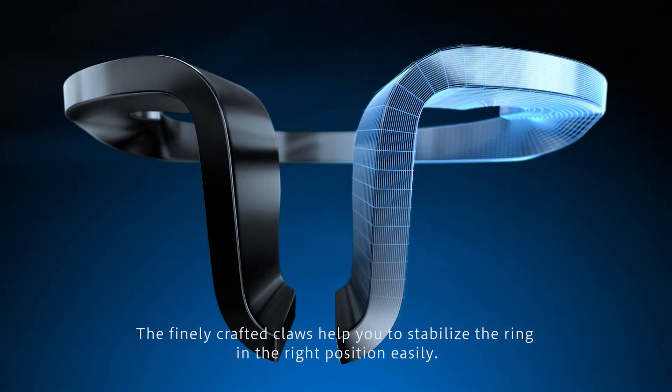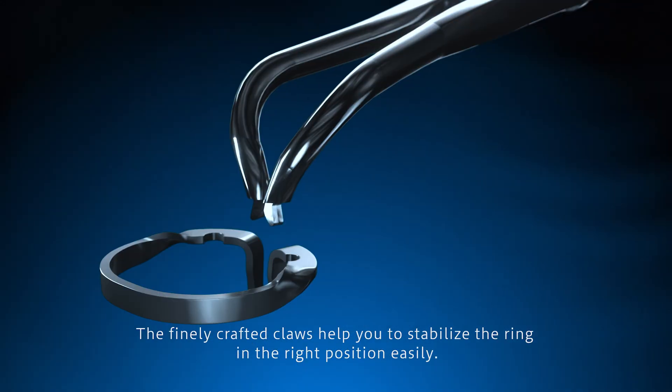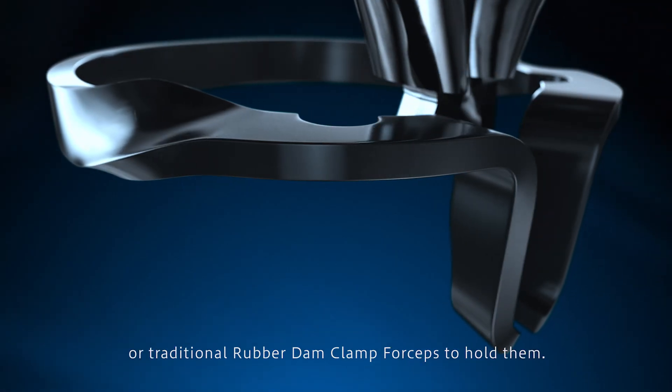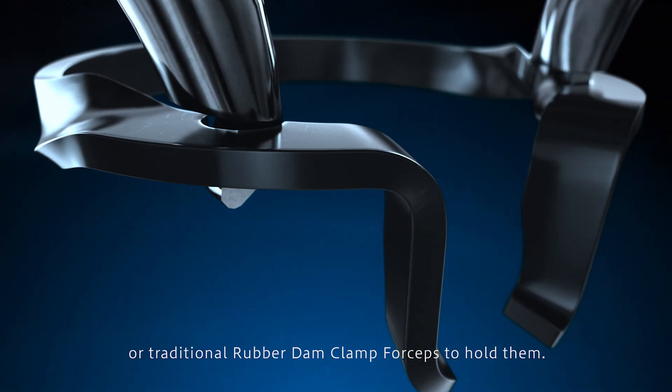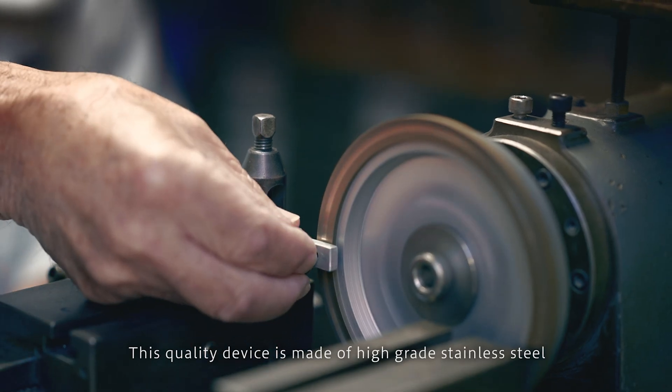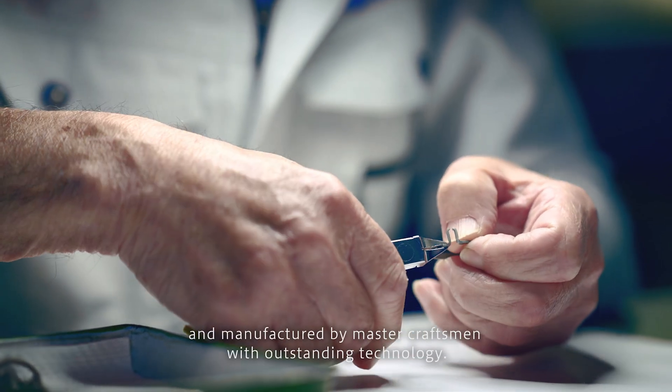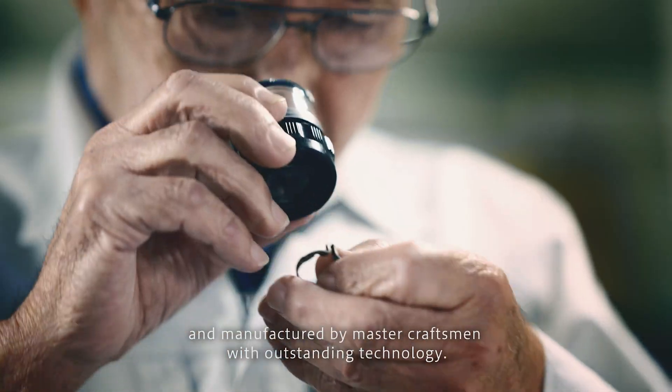The finely crafted claws help you to stabilize the ring in the right position easily. You can use either ring placement forceps or traditional rubber dam cramp forceps to hold them. This quality device is made of high-grade stainless steel with protective oxide coating, manufactured by master craftsmen with outstanding technology.